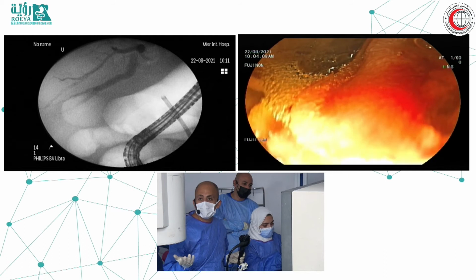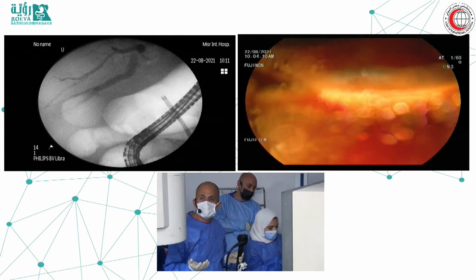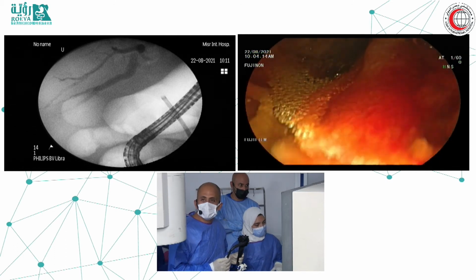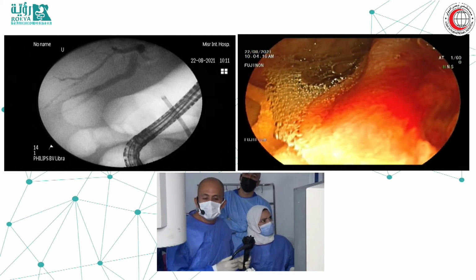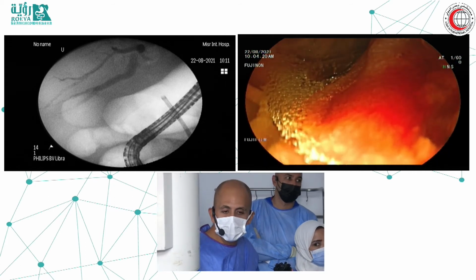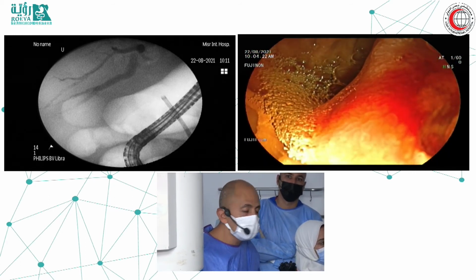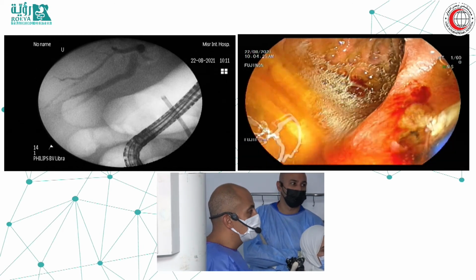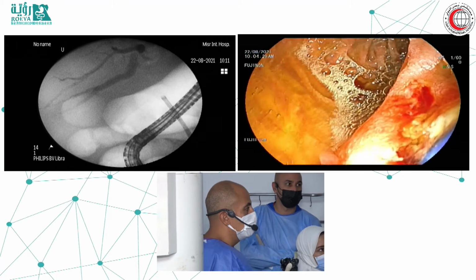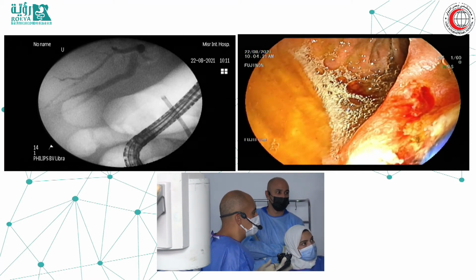However, like the colonic polyps, when we see this very irregular vascularization, this is again pro having a tumor. But I think again the definitive answer will be to do a biopsy. I think maybe Hany will correct me.